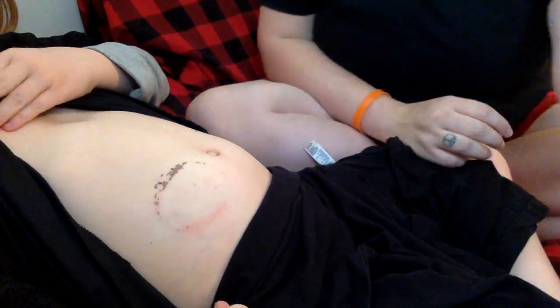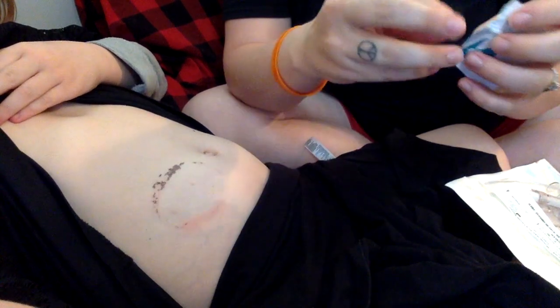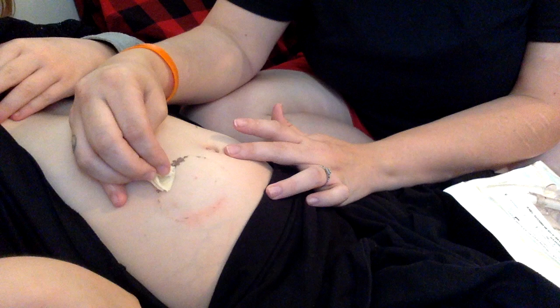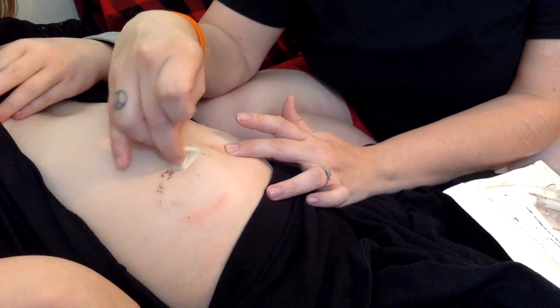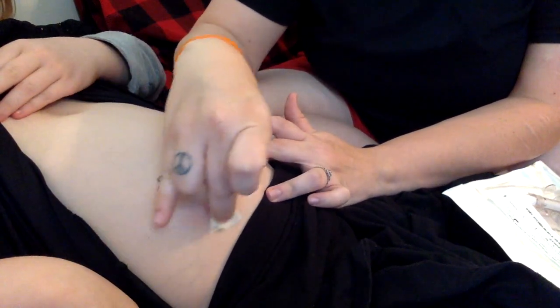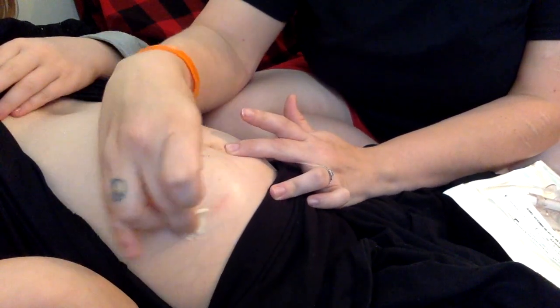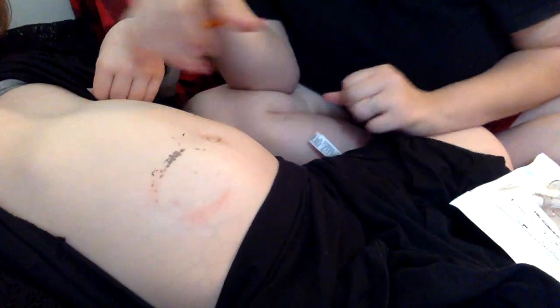What we do after we clean it is we use this stuff. It's called Skin Tac wipes, and it comes in a bottle, but we've always just used the wipes. And what we'll do is make a circle around where the sensor goes in. And this part is where we want the tape from her Dexcom sensor to go. So it's just going to add a little bit more adhesive to the adhesive that's already on there, and then you stick to everything. Don't touch it.